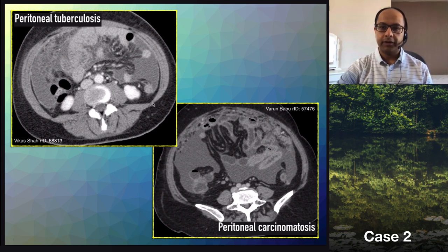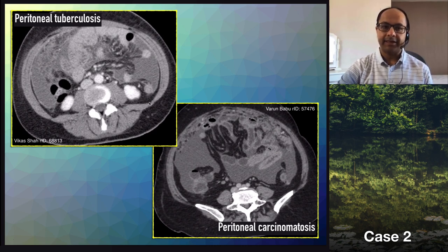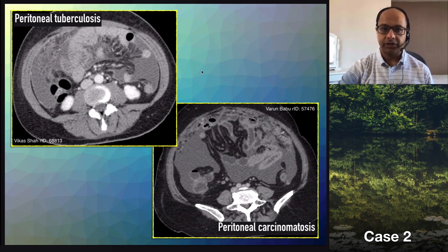There is nothing definitive on the CT that will point you to one or the other. We're going to look at different cases to make sure we understand all the different appearances of peritoneal tuberculosis and consider it as a differential when we see this kind of appearance. The similar features in both cases include a very large volume of ascites throughout the abdominal cavity with an enhancing margin indicating peritoneal inflammation, omental thickening and nodularity, and mesenteric thickening and nodularity.